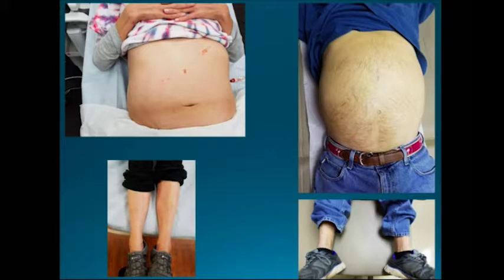And I threw this in here because I like physical diagnosis, and one of the things we hang our hats on is, hey, do they have lower extremity swelling or not? And both these guys had stick ankles. It's not 100% accurate. So yeah, they have ankles like me.